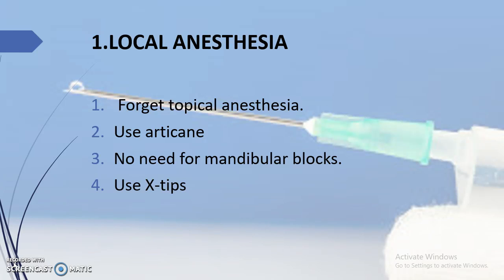We are going to start with the local anesthesia. According to Umar Reed, we do not need to use topical, as it just warns the patient that we are about to stick them. It just takes extra time, nothing else.